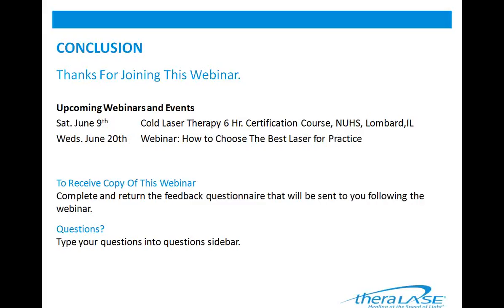One question I have here, I'll actually just accept this question, and I'll pass the next one on to Dr. Varani: can the laser be applied to the growing joint of kids? Yes, we know that you can apply laser to growth plates. We do treat children over growing limbs safely with the laser.